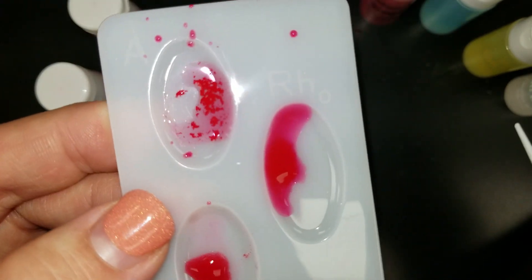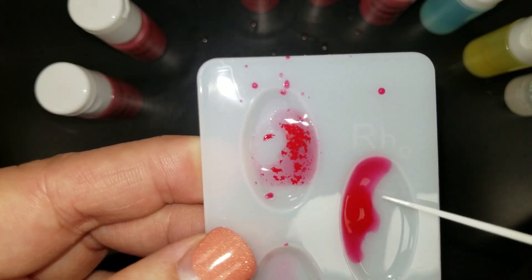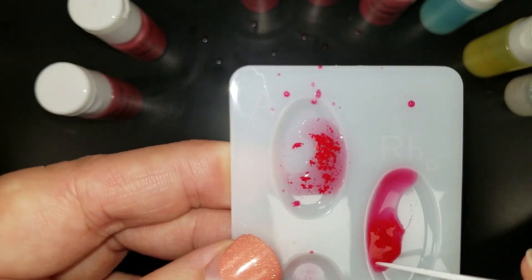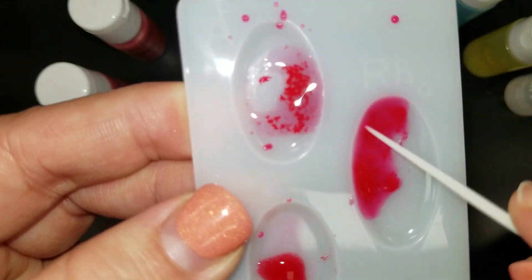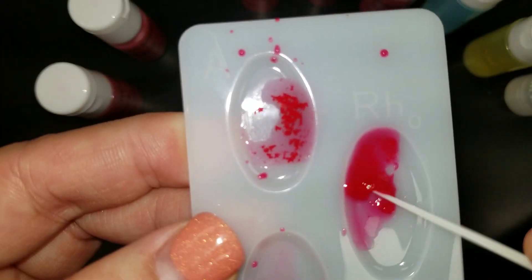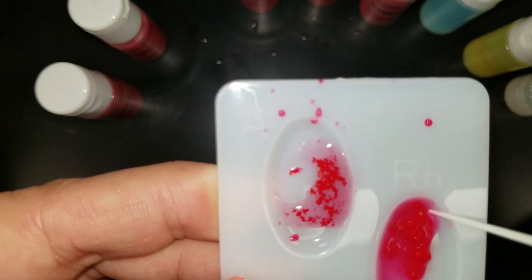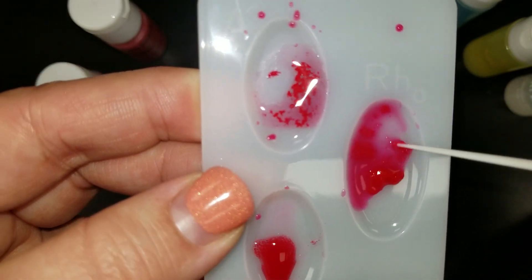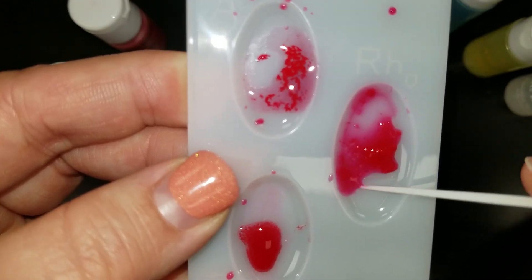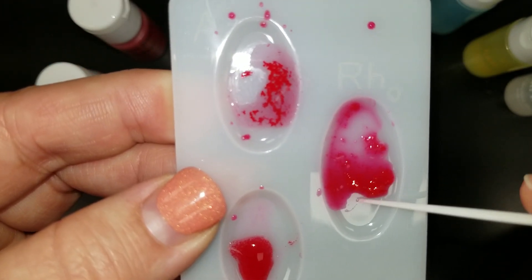Now I'm going to do my last antigen over here, the Rh, and what's really groovy about this stuff is it almost becomes like jello. So notice when I mix this up, it's all clumpy, and it's become sort of like a little melted jello. That's what a positive for Rh looks like.